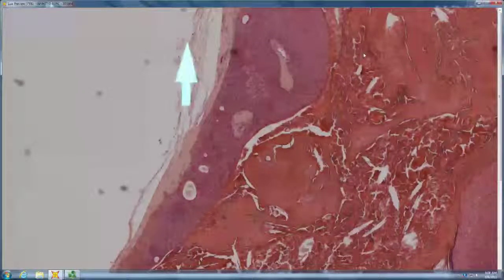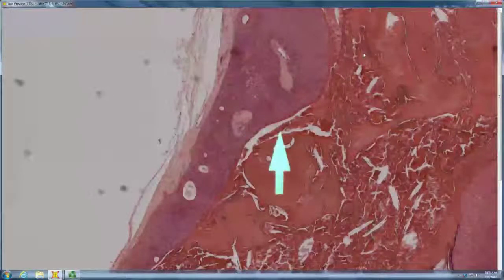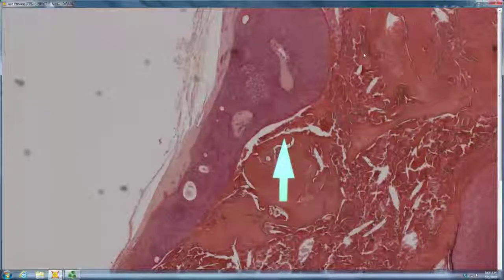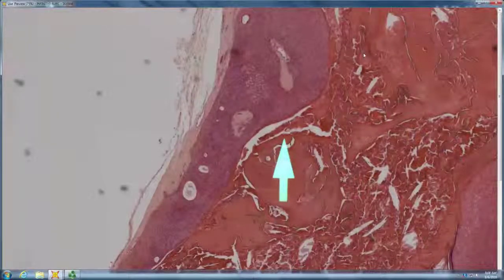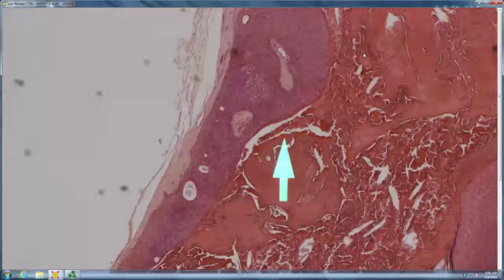How about here where it has clear glycogenated areas? Tricholemmal, but it also has hairs in it, so it clearly differentiates towards matrix as well. So do you know anything that's cystic that differentiates towards all portions of the hair follicle?